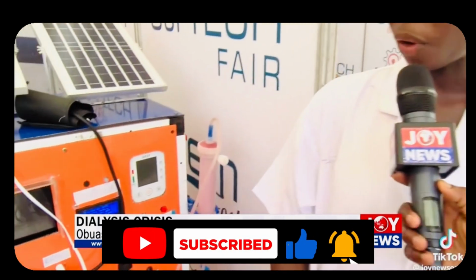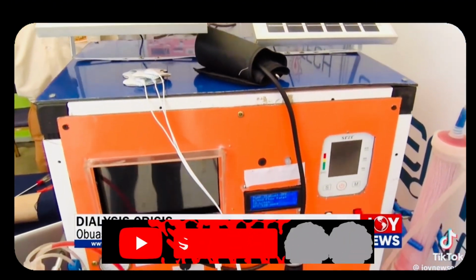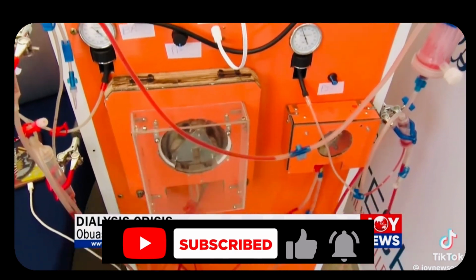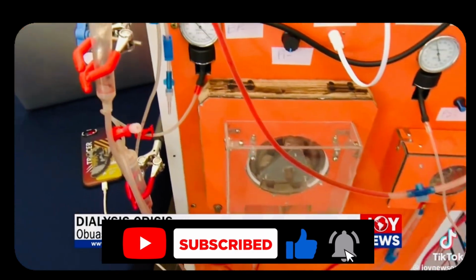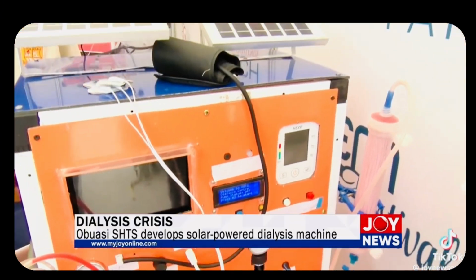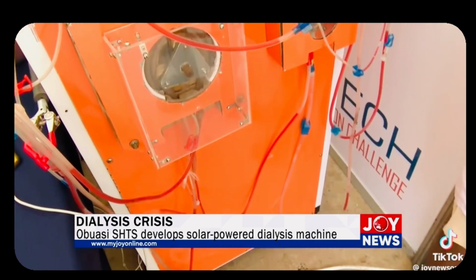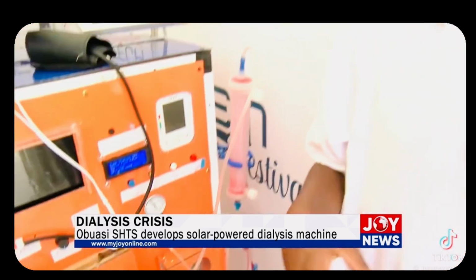Now, what do you have here? Please, this is a solar-powered homemade dialysis machine. And how did it come about? When a person's kidney gets injured or diseased from an accident or a disease like nephritis, and the kidney can no longer perform its function of filtering toxic substances from the body like urea, excess salt, dissolved minerals, and excess water, then the nephrologist will opt for a dialysis treatment to get those waste substances out of the body.